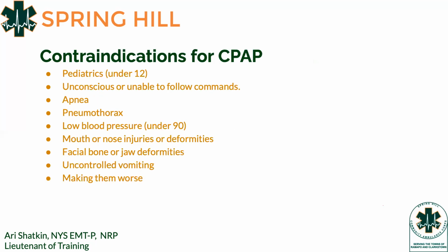All right. And so some contraindications of CPAP are pediatrics under 12, not for any specific reason, just because that mask won't fit on their face and we don't have the pediatric sizes. It's as simple as that. If there is a pediatric size, you can use it. But we just don't have the pediatric sizes for them to use. And typically it's under 12, but use your best judgment. If the mask can fit on their face, they can be considered an adult.